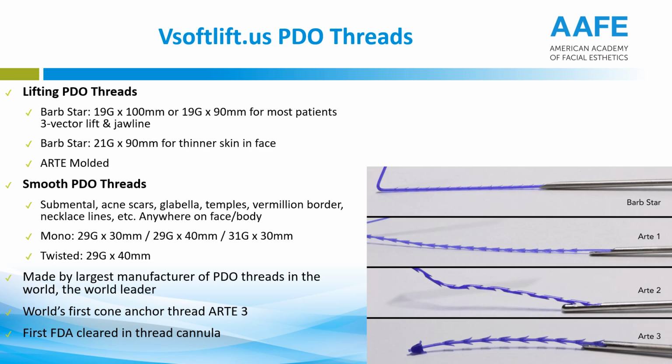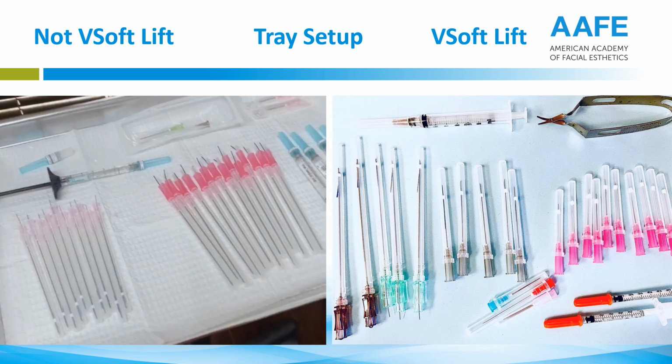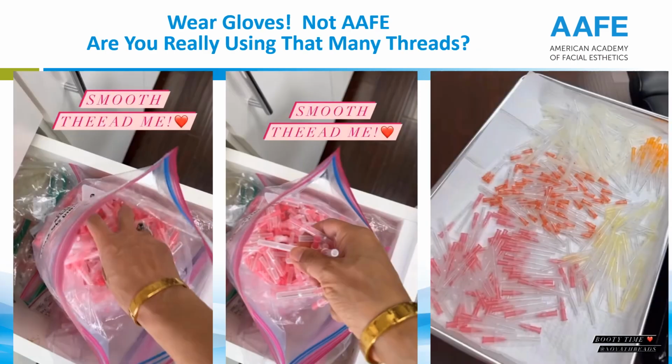And again, I love this. This is great. Look at the tray setup on the left, which is not vSoft Lift. Look at the tray setup on the right, which is vSoft Lift, with a very comparable case between the two. And again, these people post this all the time as well. And for the love of God, don't use bare hands when you're grabbing a whole bunch of smooth PDO threads.